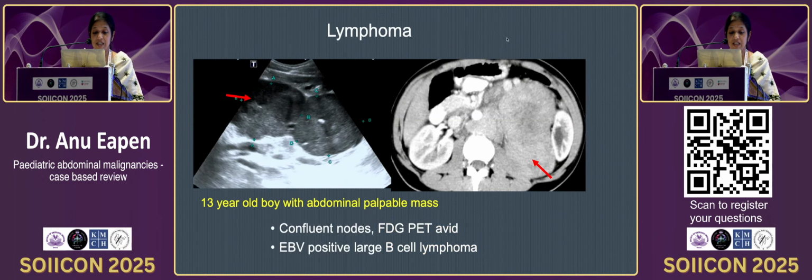So another child, a 13-year-old boy with a palpable mass. You can see bulky, confluent adenopathy. This was PET avid, and this turned out to be a large B-cell lymphoma.